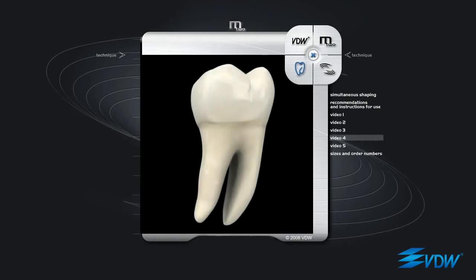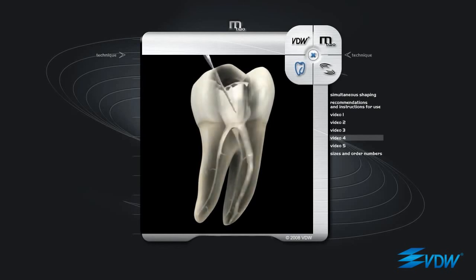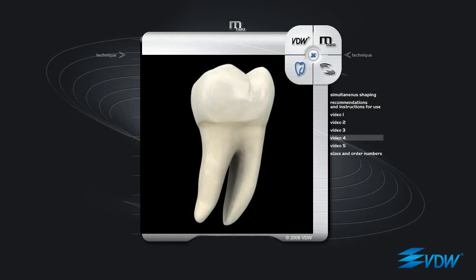The fourth and last instrument is an ISO 25, taper 06 — very effective and flexible, able to reach full working length even in curved canals without altering the apical anatomy. Every instrument reaches the apex with conical and coronal widening, using passive filing if required. This technique is called simultaneous shaping.